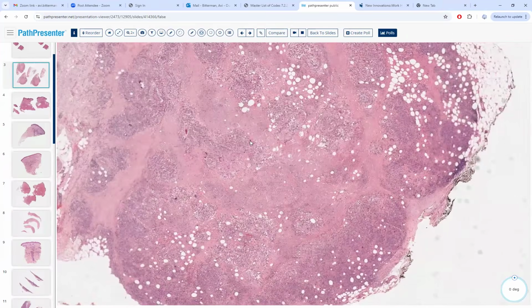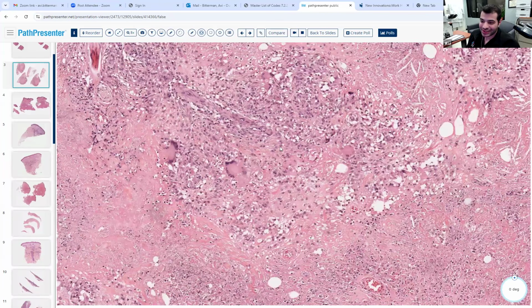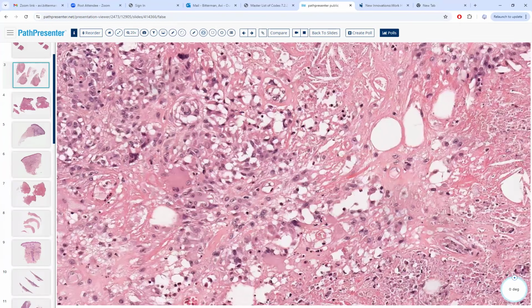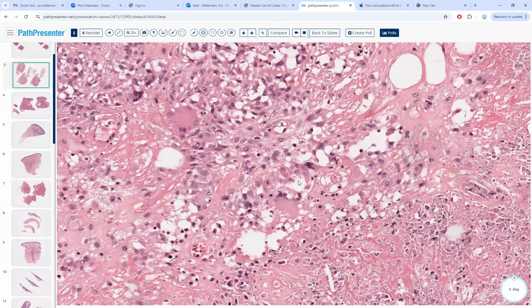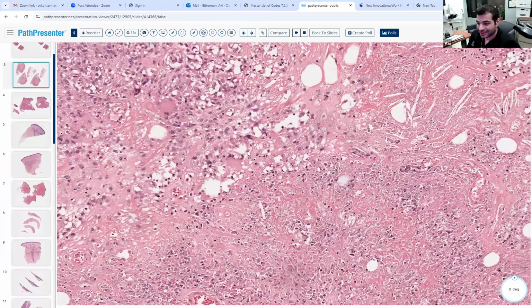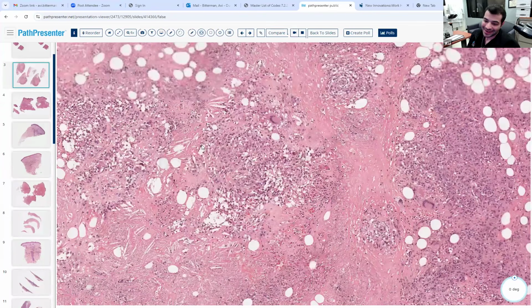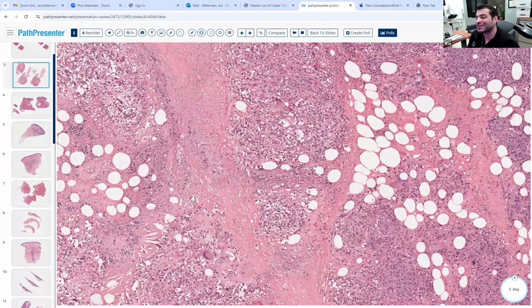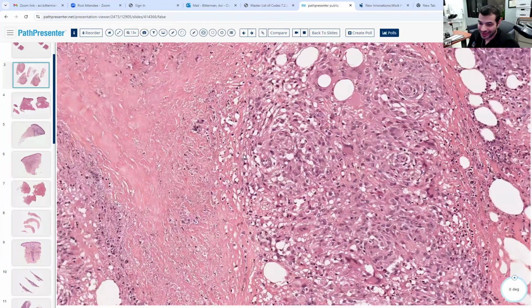Multinucleated giant cells. Some describe these as wreath-like giant cells. What else? Some areas of necrosis. Necrobiosis isn't true necrosis, at least according to some, because the collagen wasn't alive to begin with.